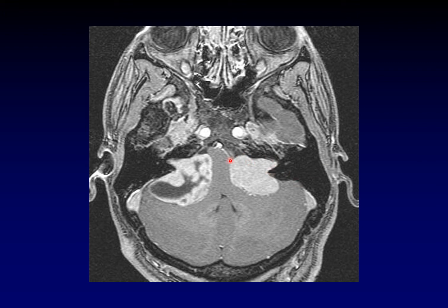Notice how uniformly this vestibular schwannoma is enhancing. Sometimes they don't get cystic.